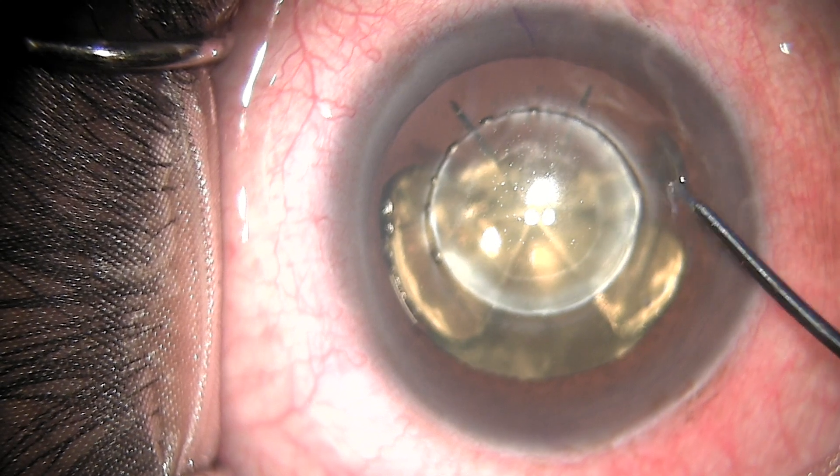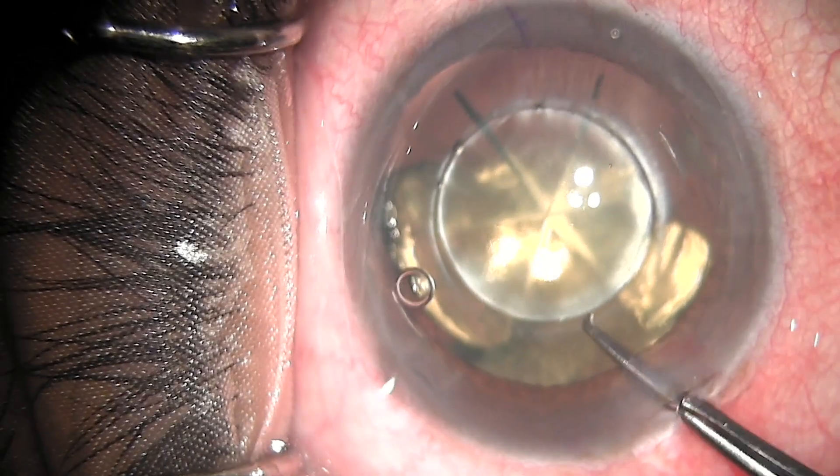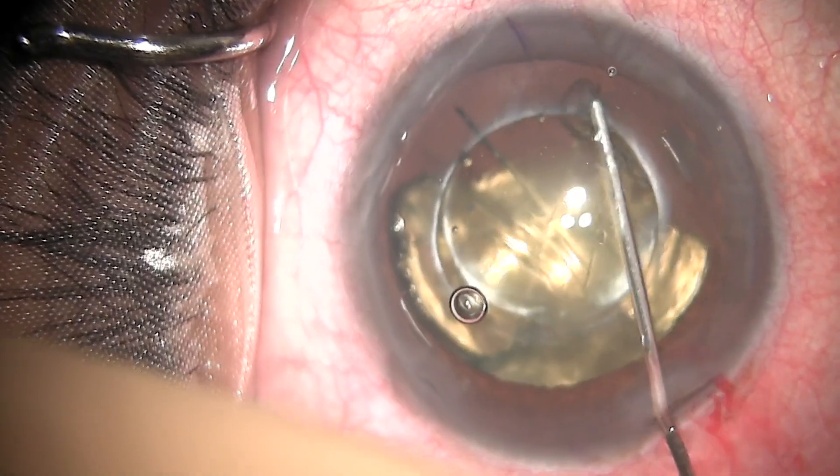I am presenting a case of FLACS with Femtis Comfort Intraocular Lens. The patient has undergone Lensar with a 4.9 mm capsulotomy. I have done the LRI and removed the free-floating capsulotomy, followed by hydrodissection.